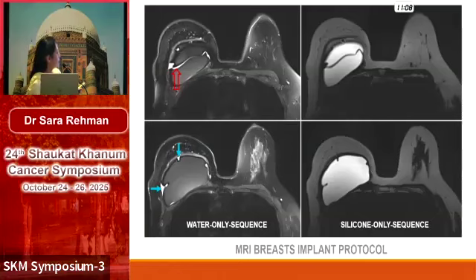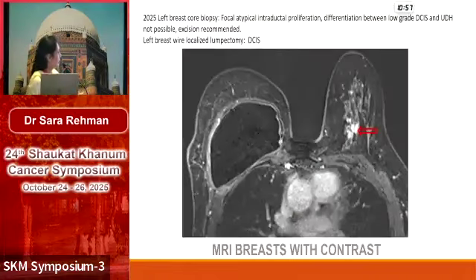And this is a complex radial fold which appears horizontally oriented through the implant, but it has got fluid signal, so it should not be confused with implant rupture. In the same patient, the dynamic scan demonstrated incidental area of abnormal enhancement in the contralateral side. So this was biopsied and excised with wire localization and was found to be DCIS.